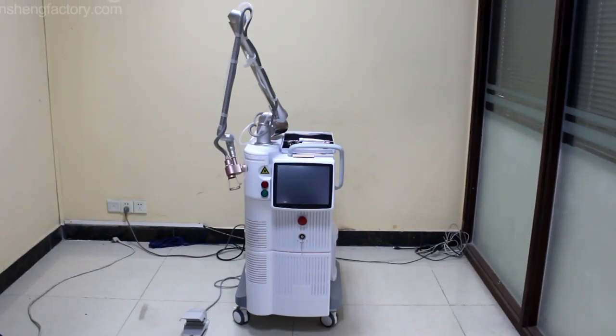Hello everyone, this is Doris and today let me introduce our latest RF2O2 fractional laser machine for you.